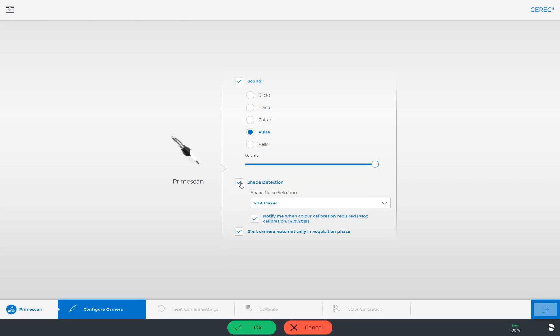Whenever you modify a setting, you are asked at the lower edge of the screen to either confirm your entry with OK or reject it by tapping Cancel.